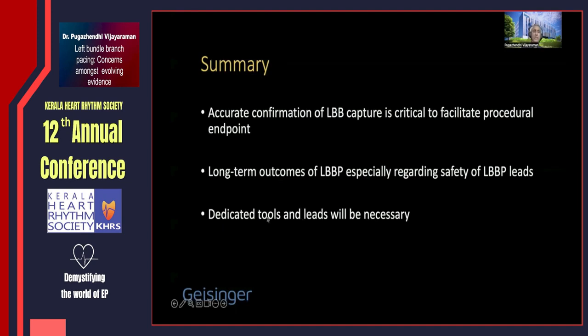We do need dedicated tools, not only delivery tools, but leads that are designed to withstand the stress that they undergo during left bundle branch pacing and during the long term. I think all this will be necessary to steer a clear path of successful left bundle branch pacing and improved outcomes for our patients.